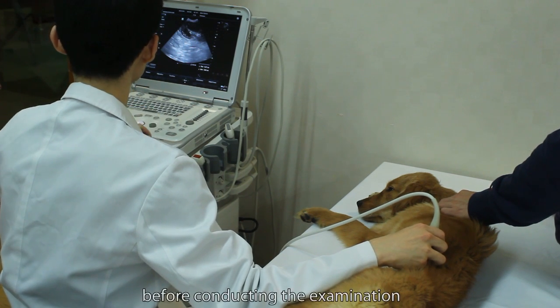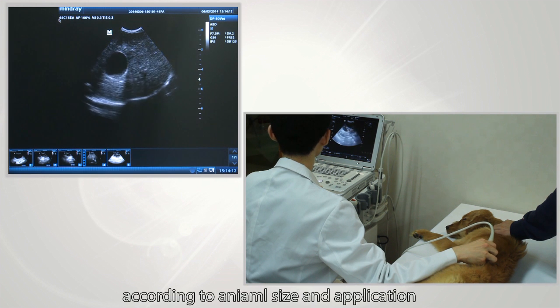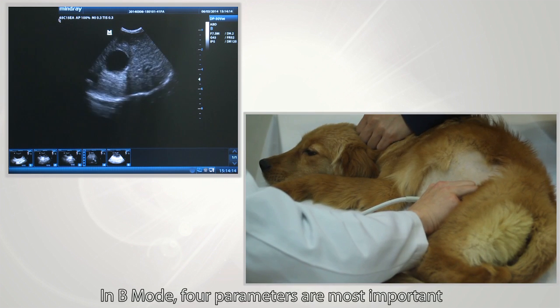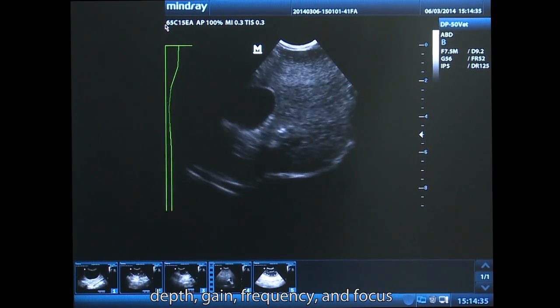Before conducting the examination, adjust parameters and use the right settings according to animal size and application. In B-mode, four parameters are most important: depth, gain, frequency, and focus.